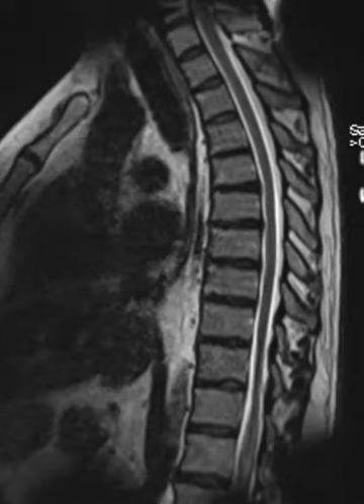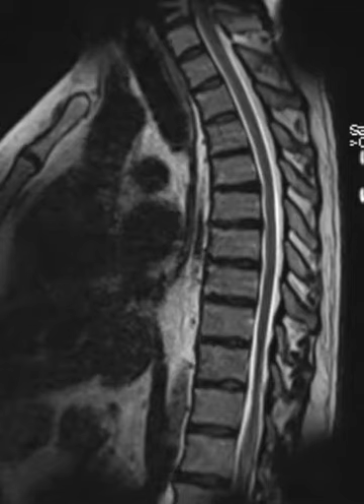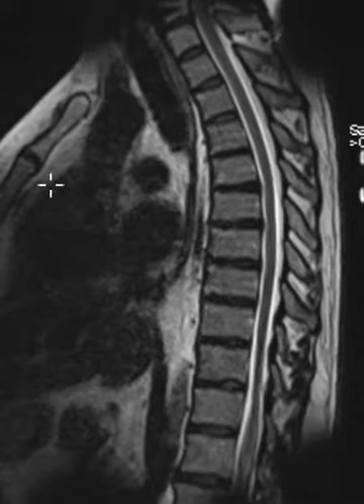Hello, this is Dr. Gay from First Slick MRI, and this is a 54-year-old male with complaints of back pain, more of a mid-back, lower thoracic region pain. He also has pain in the left flank area. He says it's around where he thinks his kidney is, and maybe some peripheral pain even going into the skin. His doctor thought it could be a thoracic problem.